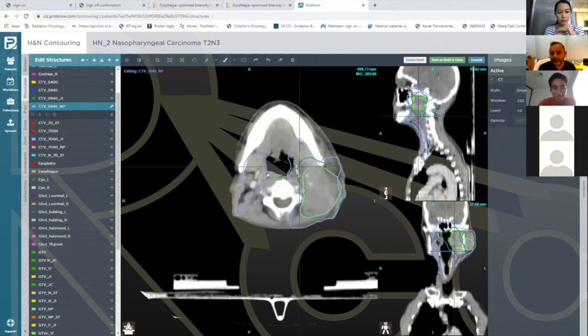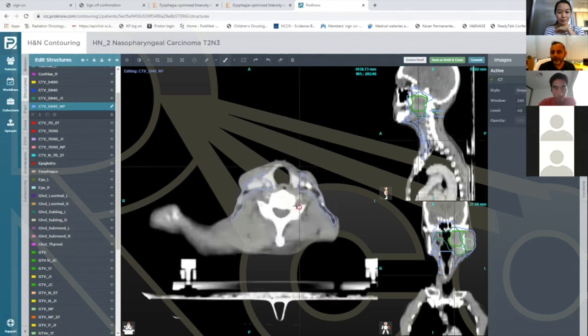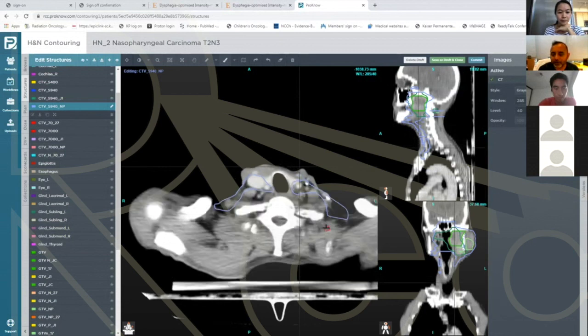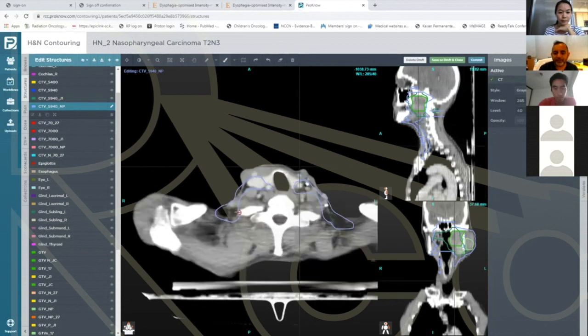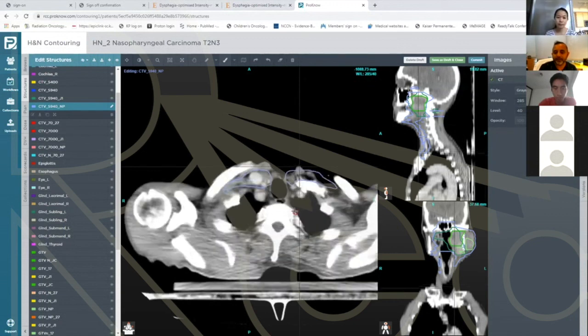So I would have done this. And then once I come to the hyoid, I would have done exactly what you're doing here. So this looks really good. And then down here, obviously, I think you did a great job. I think the hardest part is the 5B coverage. In a nasopharynx patient, I'm very generous about 5B coverage, so I probably would have treated a little bit more posteriorly. I just feel like there's not a lot of toxicity by covering 5B here.